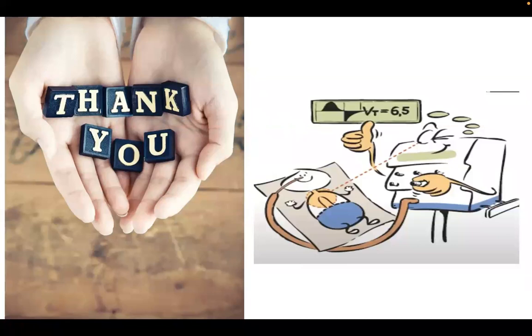That means there will be a fluctuation of volume in those scenarios. But if there is a facility for leak compensation, that can be tackled, and the baby will be comfortable during ventilation. This commonly happens in different positions of the baby; the leak changes. In other ventilators, it is very difficult to control that leak because you cannot keep a baby in a certain position, and that is not wise. So that is another advantage.